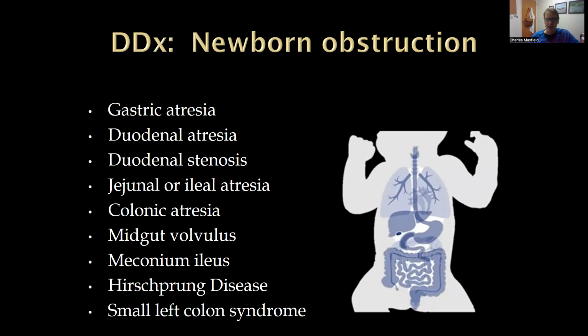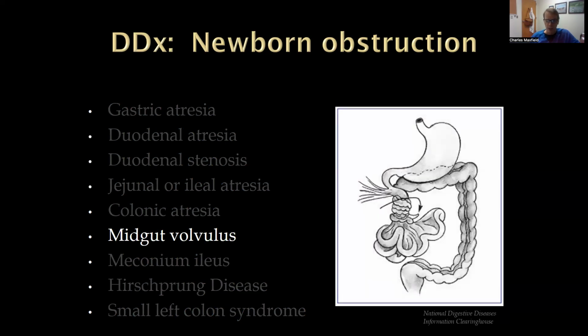There are a couple of other entities that are in the differential too that I want to make sure that you know about. I think you probably do, but it's important we're all on the same page, because this talk is really more about how to view x-rays and manage the patient than it is, I'm not going to get a lot into any individual diagnosis.